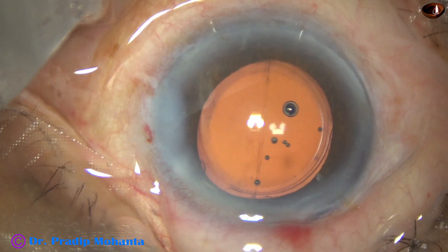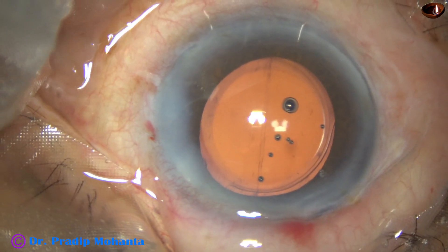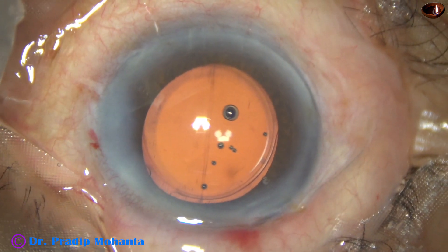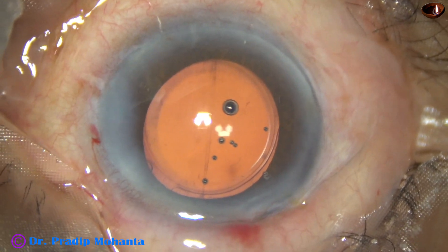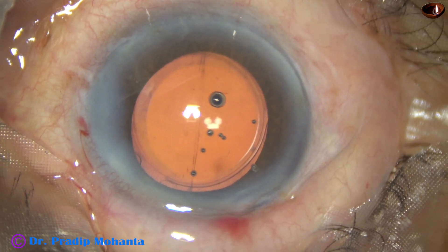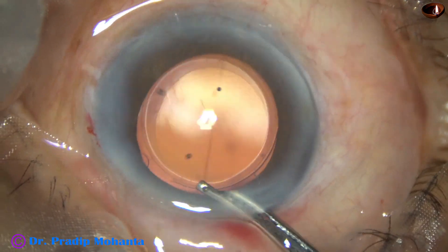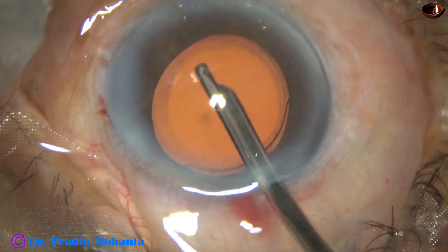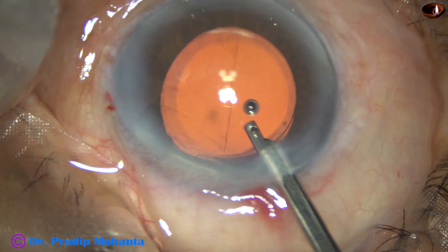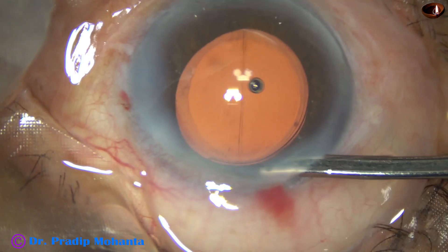And now the side port is closed by hydrating the corneal stroma. Our final lavage of the anterior chamber is done, because when we hydrate the side port, a lot of particles go inside the anterior chamber. Do a nice lavage of the anterior chamber, form the anterior chamber with the help of this Simcoe, and then conclude the case.